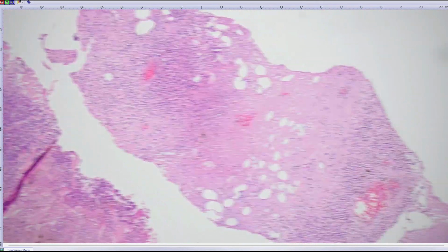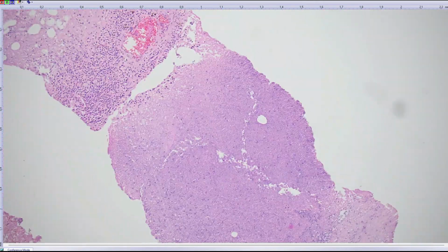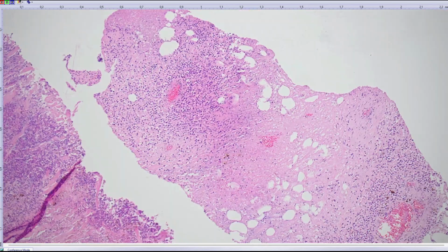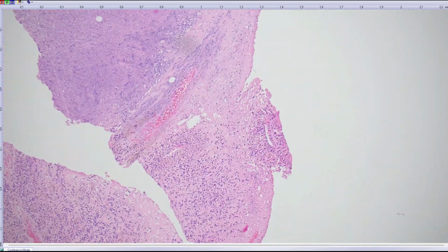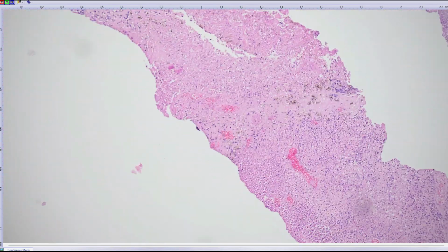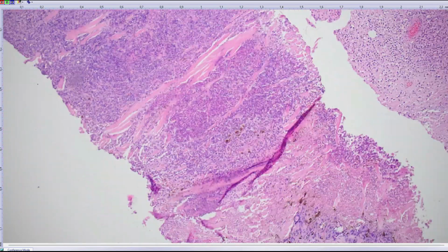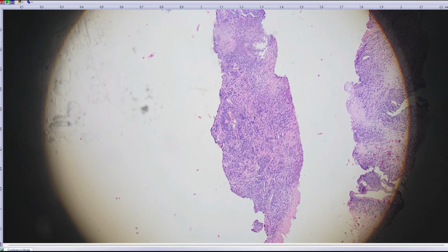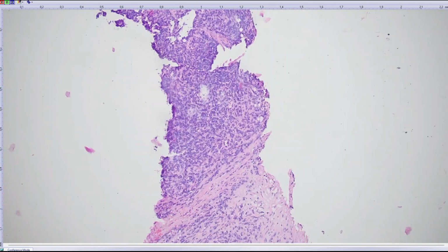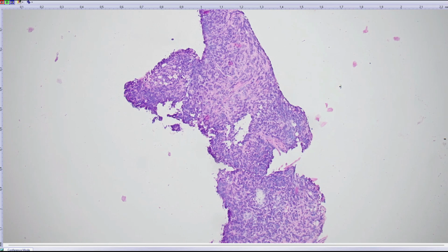Straight out, you can see this is a largely necrotic tumor. I don't know from which location this is. Doesn't really matter. One of the tumor lesions. And so widespread necrosis, and then some round cell or epithelioid neoplasm. Let's look at some other slide. Maybe there was something better. Okay, here maybe. So the tissue is really smudged, but here at least it's not so necrotic.